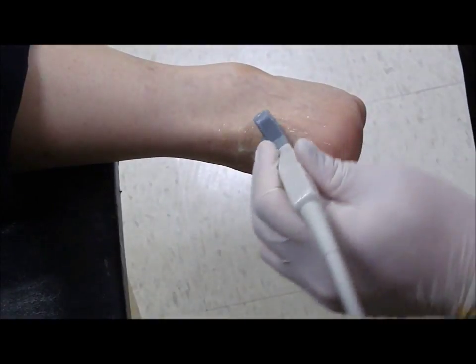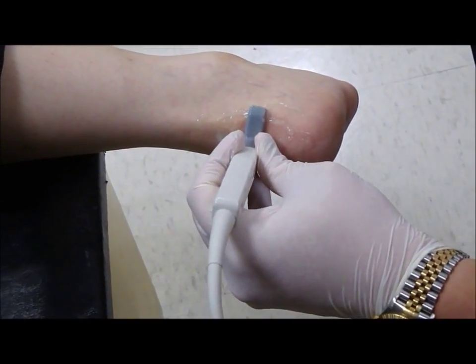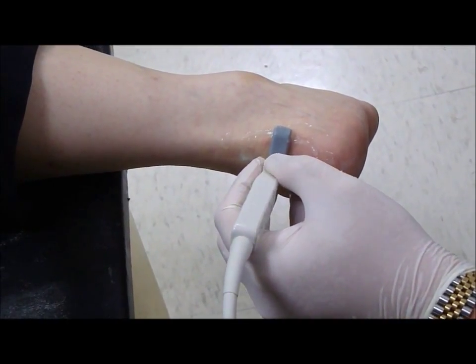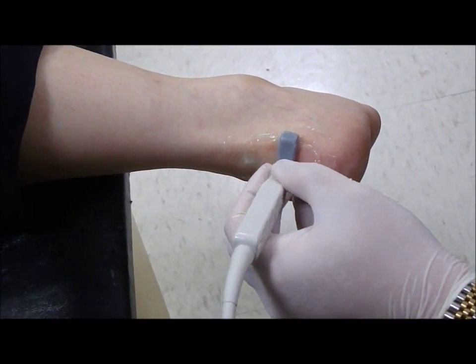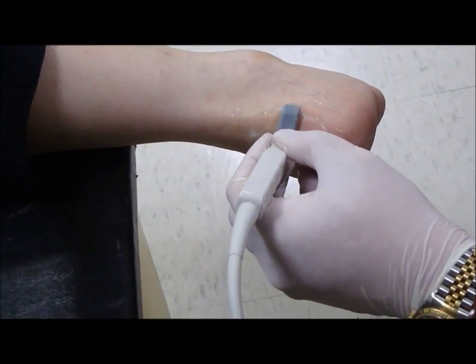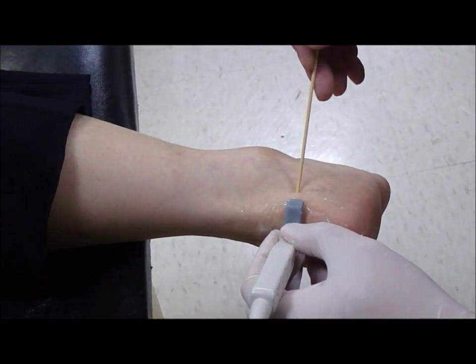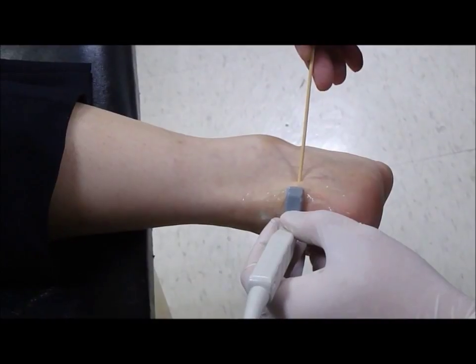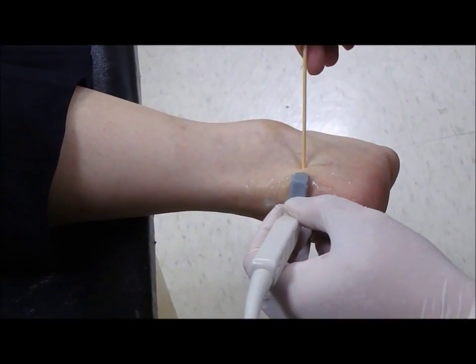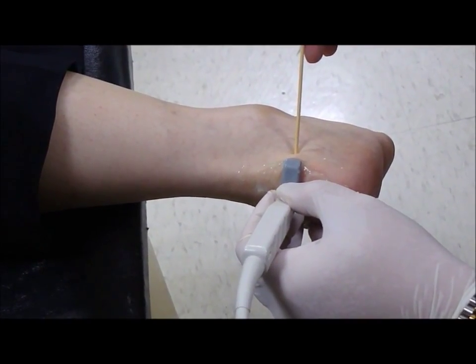When you turn the probe by 90 degrees, you can then see the retrocalcaneal bursa under its transverse view. It is under this transverse view in which the needle is inserted for injection into the retrocalcaneal bursa for the treatment of retrocalcaneal bursitis.